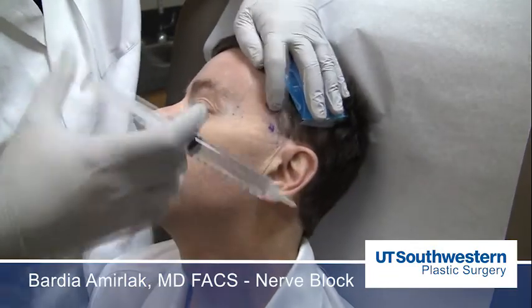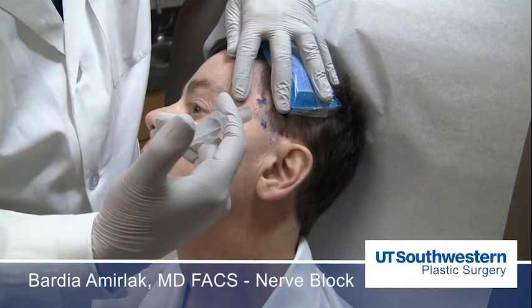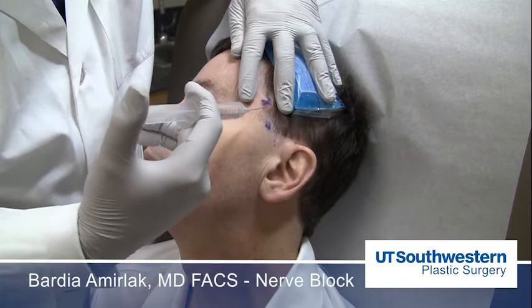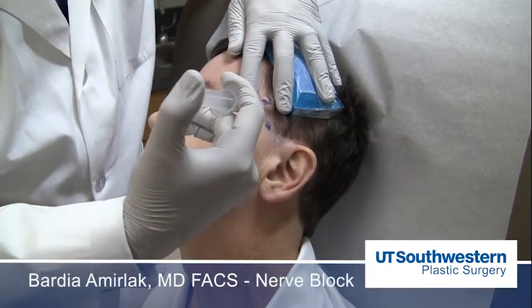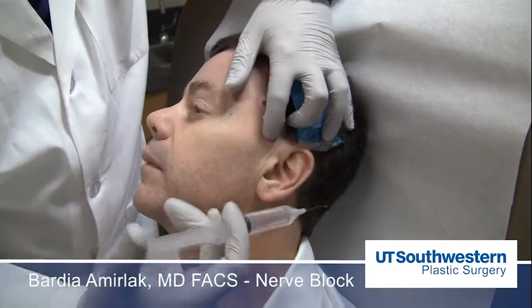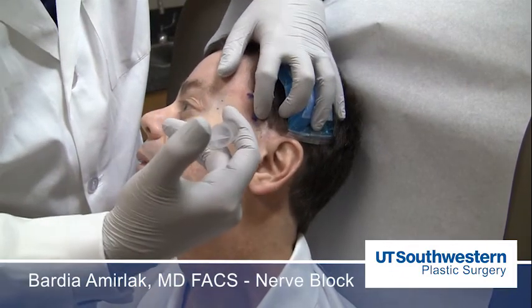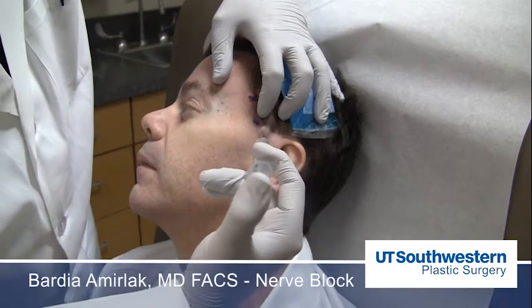This is mixed half and half with lidocaine without epinephrine and marcaine. First, we're going to start with the auriculotemporal nerves. I don't typically aspirate, but I know I'm close to the vessel, so I like to move my needle. This is more of a superficial injection, and after the superficial injection I do a little bit deeper injection — approximately 1 to 2 cc's in the auriculotemporal area. This is the distal and the more proximal one above the TMJ, also about 1 to 2 cc's.